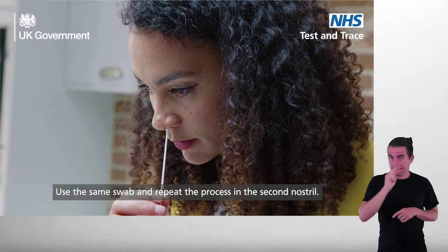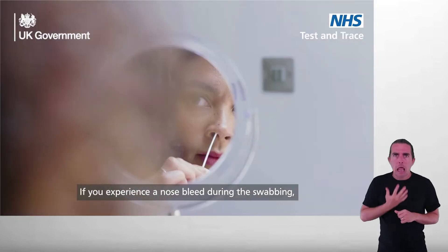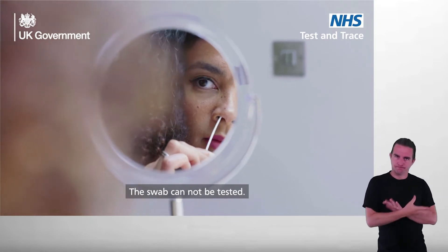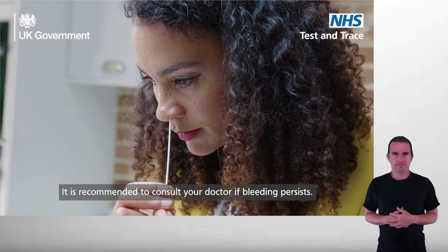Second nostril: use the same swab and repeat the process in the second nostril. If you experience a nosebleed during the swabbing, please stop swabbing. The swab cannot be tested. It is recommended to consult your doctor if bleeding persists.